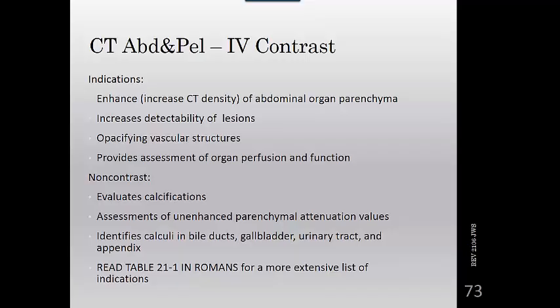So modern CT scanners can accomplish this. As a result, the pre-contrast scans are now seldom obtained for routine abdomen studies, just to save radiation dose, but it may be useful for specific indications such as fatty infiltration of the liver or other organs, or other alteration of parenchymal attenuation.